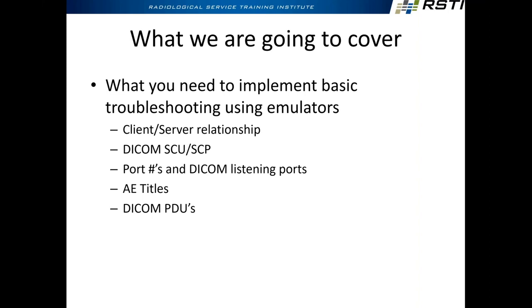We'll talk about AE titles, what they are, some limitations, rules, as far as the standard, that kind of thing. And then what are called DICOM PDUs. Really, this is the weeds part of this class right here, protocol data units. What that's referring to is every DICOM communication follows the same format. No matter whether you're printing an image, pulling a work list, doing storage commitments, or sending an image to PACS, they all follow the same standard. There are these PDUs, which is the order that the communication happens when devices are communicating on the network.